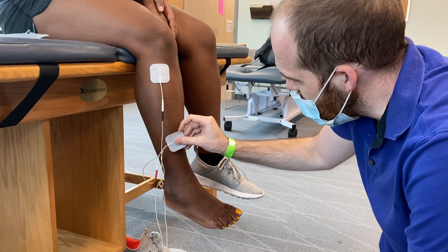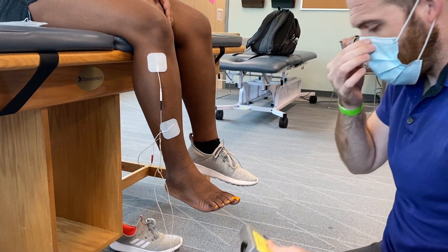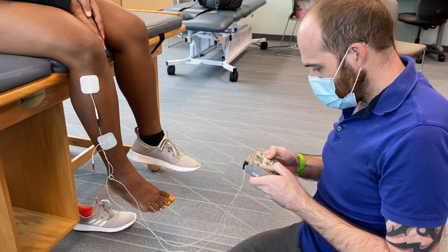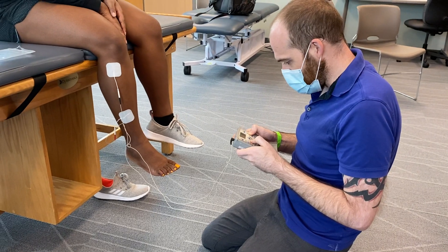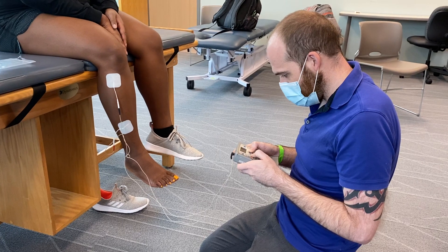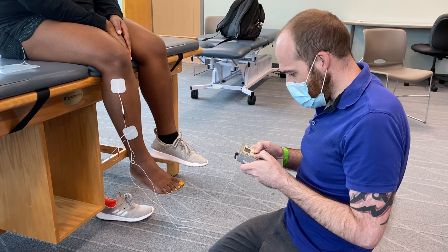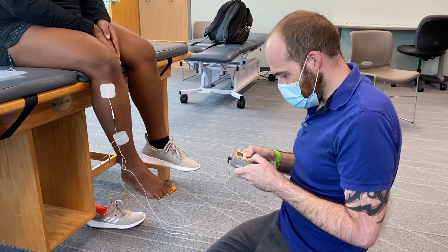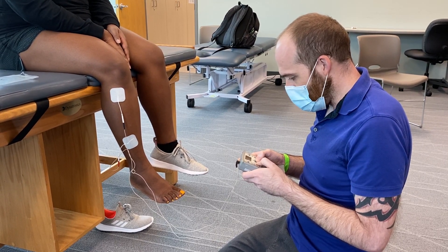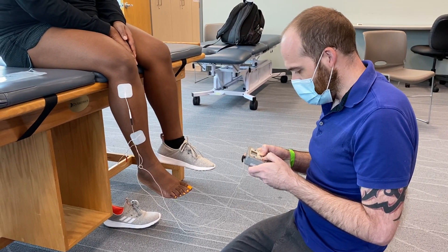We may get lucky and this may be the right setup, but electrode placement is variable between people so we may have to change some things. Let me set up my machine. Settings: custom, 10 on / 50 off, 50 pps. It's a small muscle so asymmetrical waveform, synchronous, ramp time is still two. Pulse width — small muscle — let's go 150. Ten minutes.